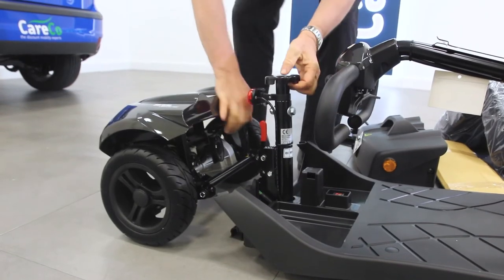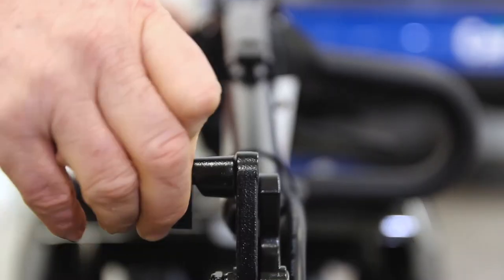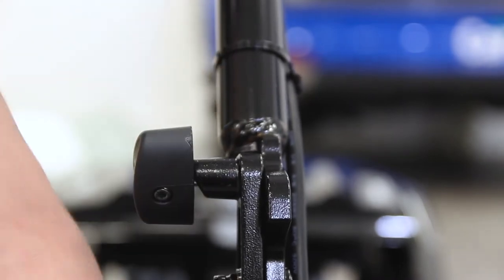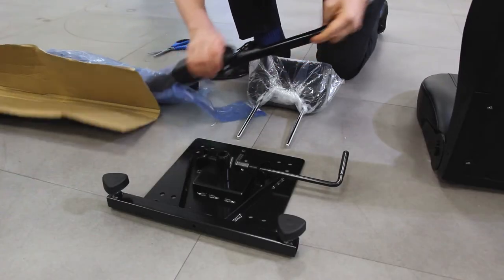Reconnect the front and rear sections of the scooter — you'll hear a click when they are fully locked. With the tiller raised and locked in an upright position, drop the battery back into place. You are now ready to put together the seat.